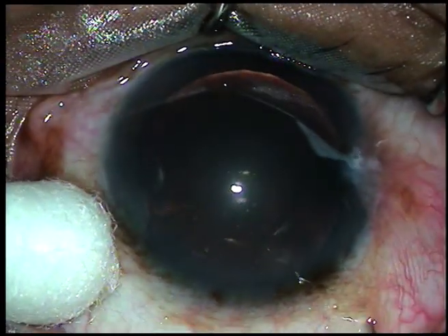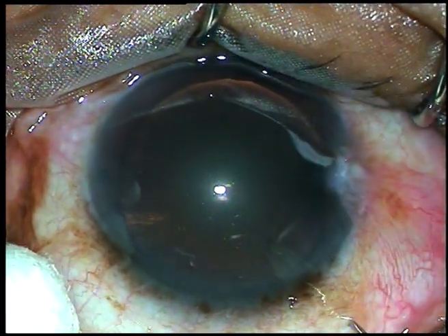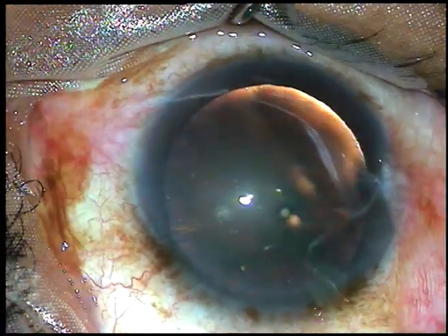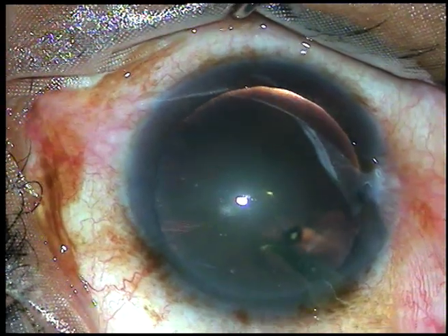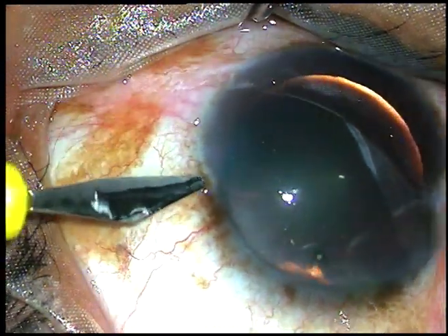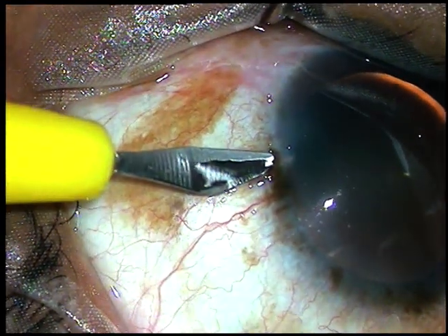The needle goes tangentially first and then towards the vitreous cavity. Under direct visualization, you ask the assistant to inject. And 0.05 ml of the medicine has been injected into the vitreous cavity.